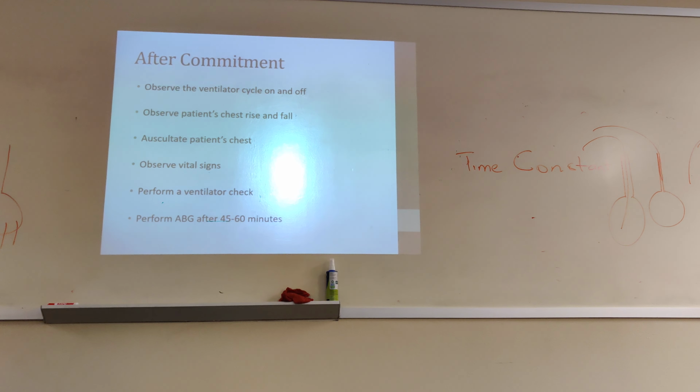So you have to document. Anything happens, OSHA comes in, they look at that. That's a legal document if you don't know that. It's a legal document. They will look at it and see who caused it. Okay? So that's why a vent check is always good.